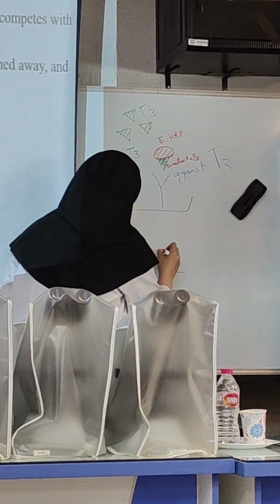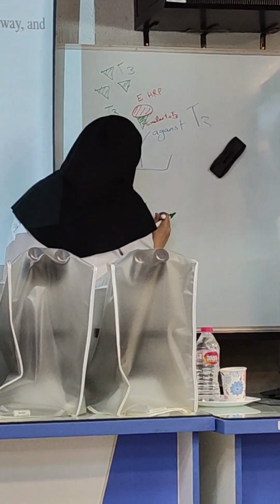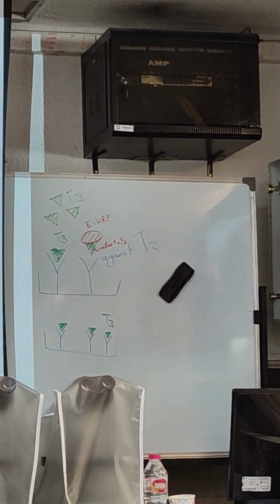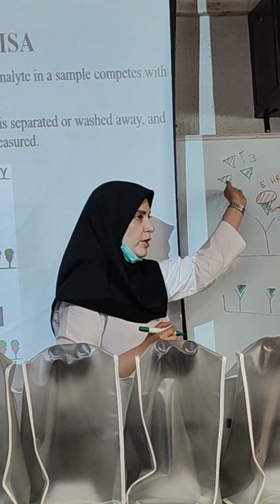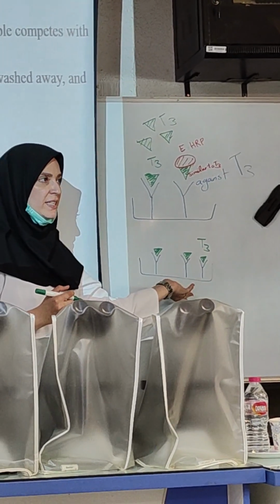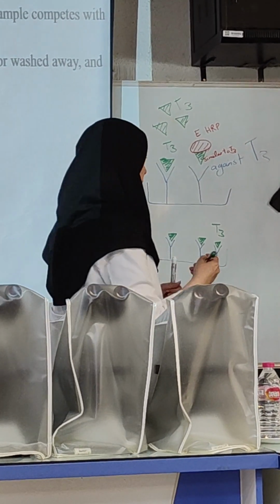What is the result? It means that all of the binding sites will be occupied by the T3. In the case of high concentration of the thyroid hormone, all of the binding sites are occupied by the T3. Is there any signal? No. What about hypothyroidism?